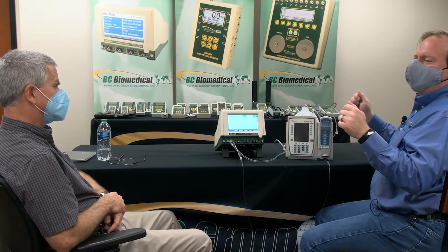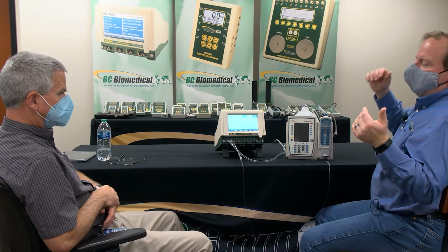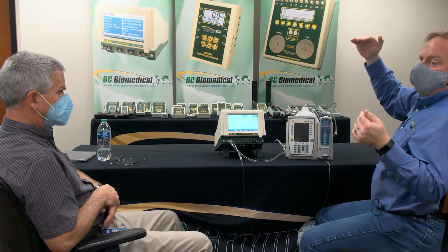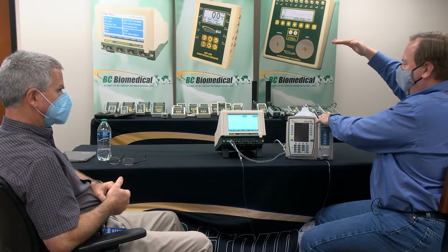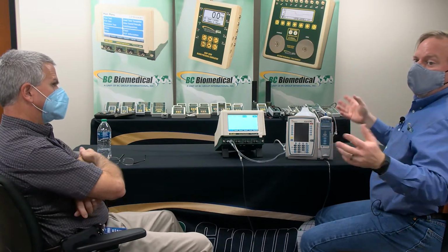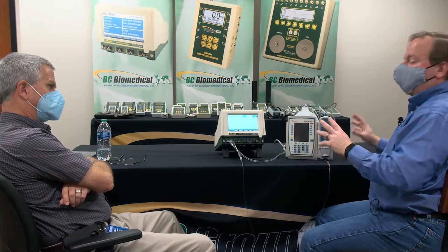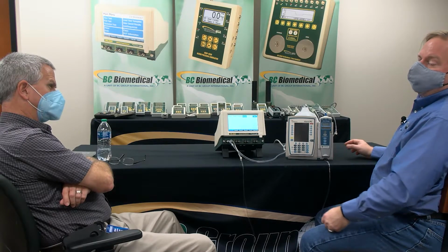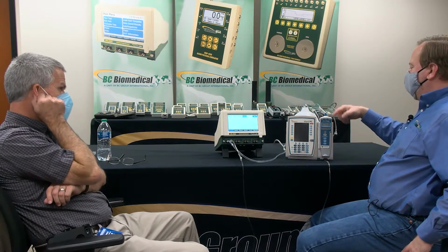Now, there may be manufacturers that have a specification that says your water level has to be this high above the pump. If that's the case, for just testing, then under these perfect conditions, now you have a 5% tolerance. But because we're drawing from the top versus an IV bag coming from the bottom, does that make a difference? That will change the pressure in this line. Right.